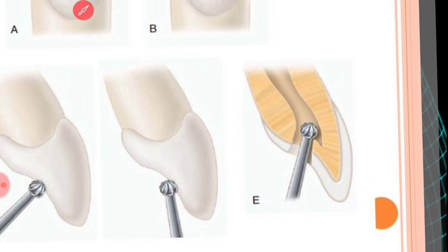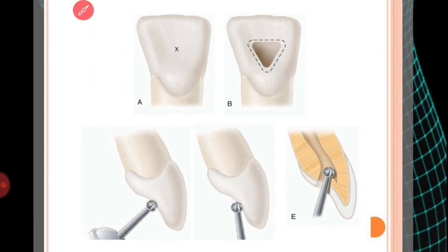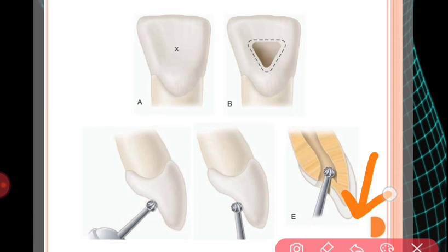And once you are in the chamber, then just feel where the overhang is and cut on the outstroke. Don't drill into the tooth.